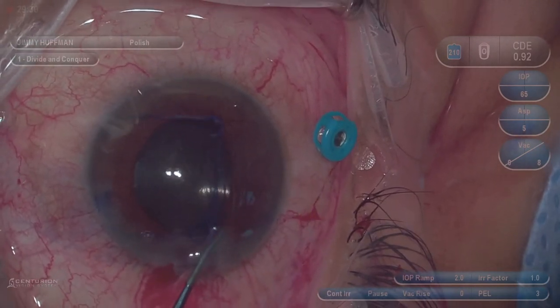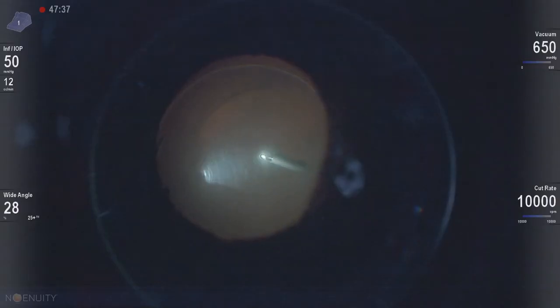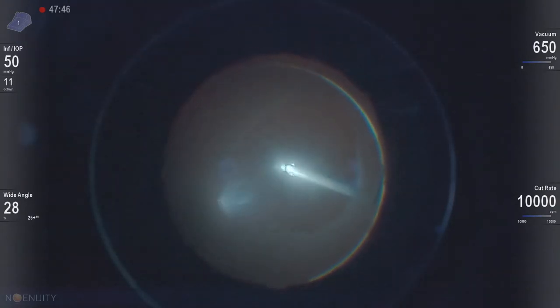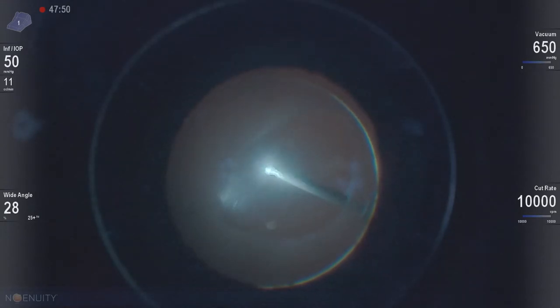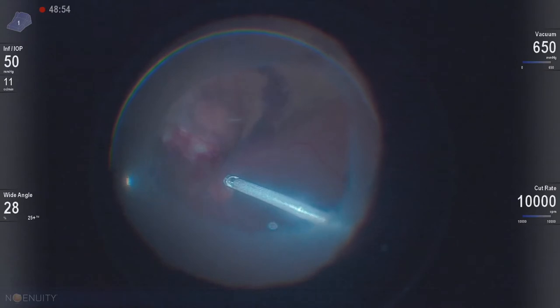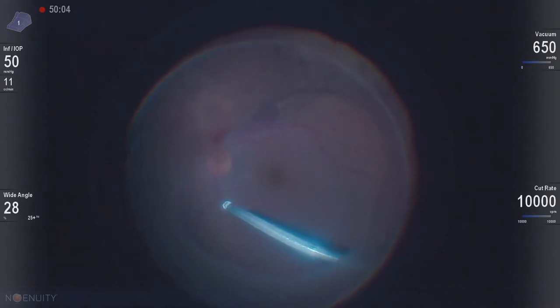You can see how nicely that's removed here. We really needed to get the cataract out of this patient's eye because he had a recurrent vitreous hemorrhage from this larger subretinal hemorrhage. You can see this dehemoglobinized blood. Really, without having his natural lens removed, we couldn't get anterior enough to get all of that anterior hyaloid out and the anterior vitreous out to ensure that this patient wouldn't have recurrent hemorrhaging. This is a young African-American fellow who just presented with this massive subretinal hemorrhage.